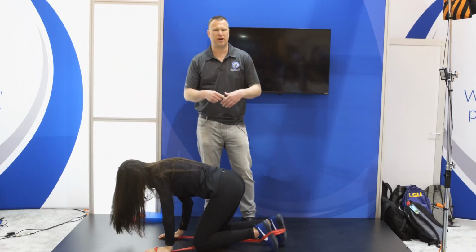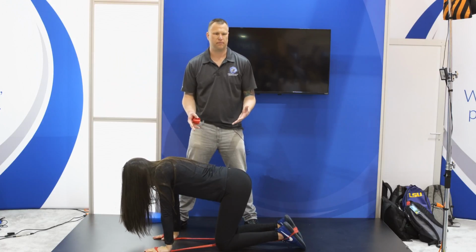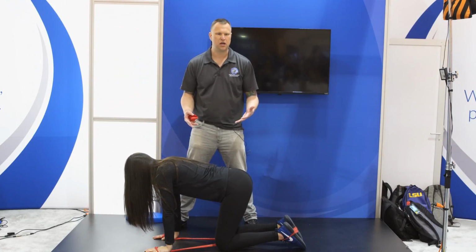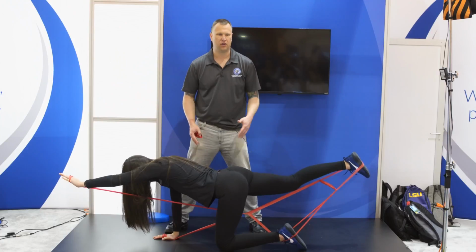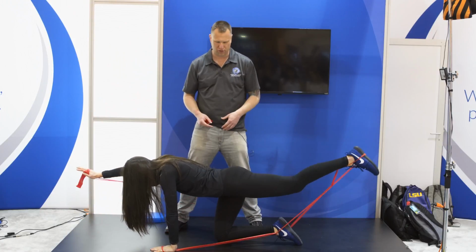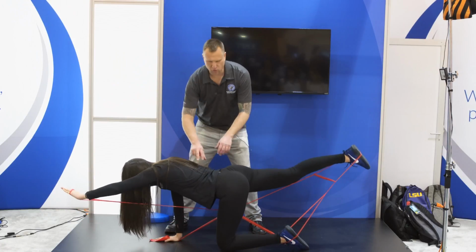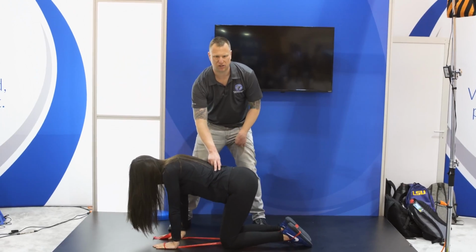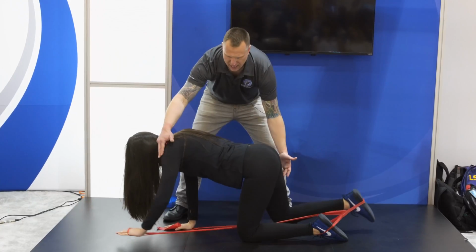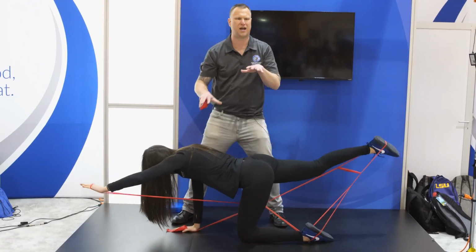Because obviously in our clinic, we might utilize a mat table or a carpeted area, but now we're creating stability through the trunk, right? So an exercise we do often in the clinic is simply a bird dog, but why not combine it with the CLX, okay? The patient doesn't have to think. We don't have to, again, be tying loops around and so forth. So we could be doing alternate bird dog, left, right. Maybe they're really weak in their core, and a lot of times in the clinic they are, and I will literally just have them stick with unilateral side and just have them repeat just that side 10 times or 15 times, as opposed to going left, right.